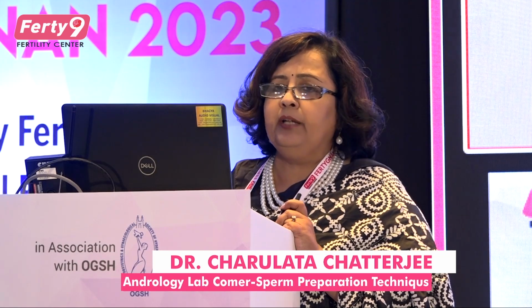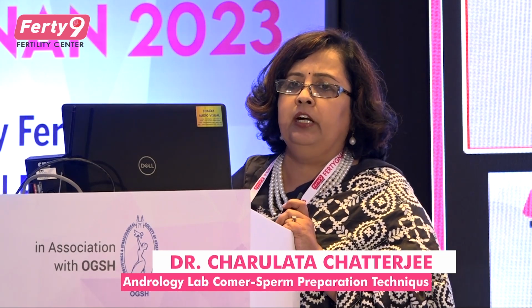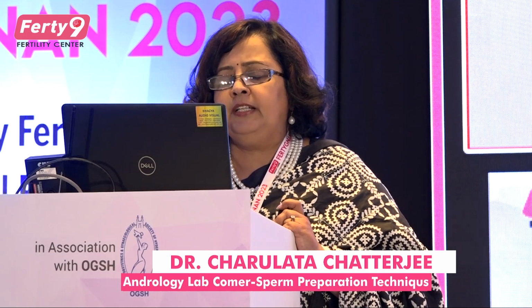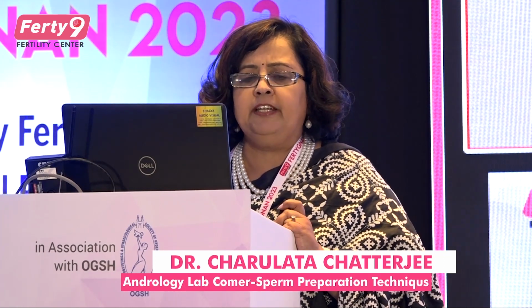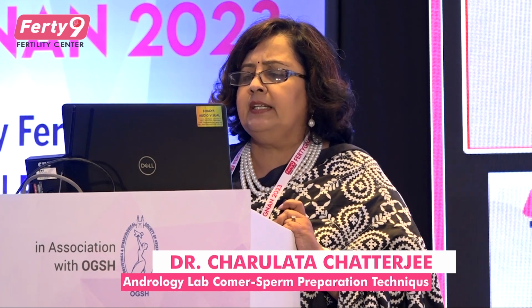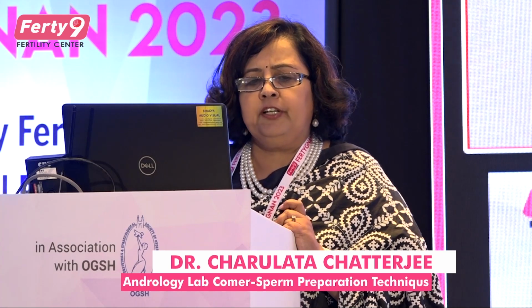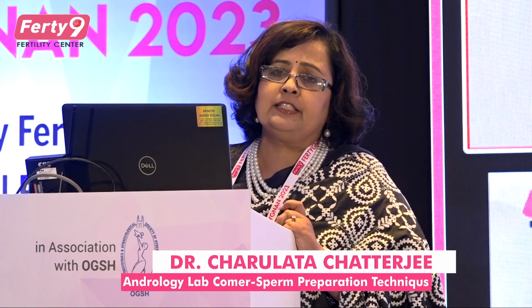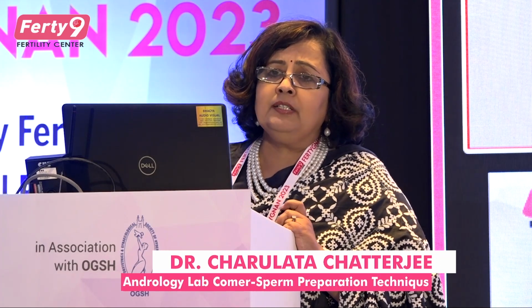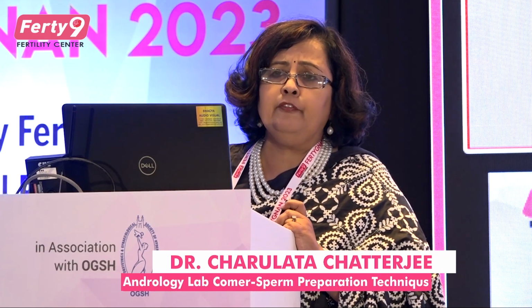Zymot is another brand which is used as a filter system. Then there is the Zeta method, which is also used but not very popular. The Zeta method is based on the electrical charge of the sperm, and there is the electrophoresis method also.